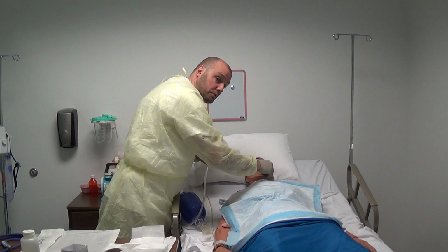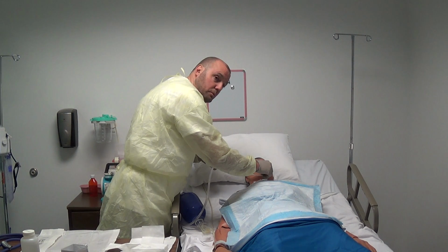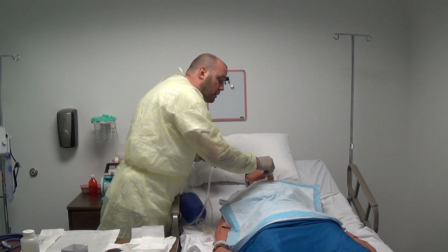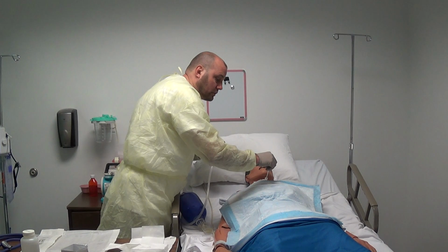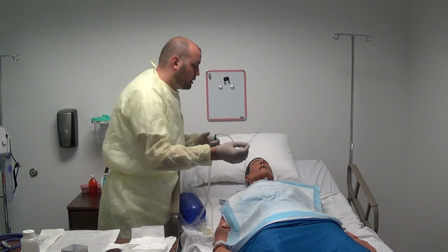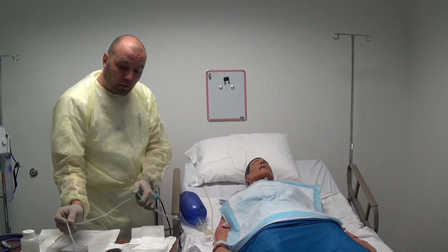On meeting resistance, I'll begin to pull back, withdraw the suction tubing, and at 1 centimeter intervals, I will provide mild suction lasting no longer than a total of 10 to 15 seconds. I will then clean the tubing.